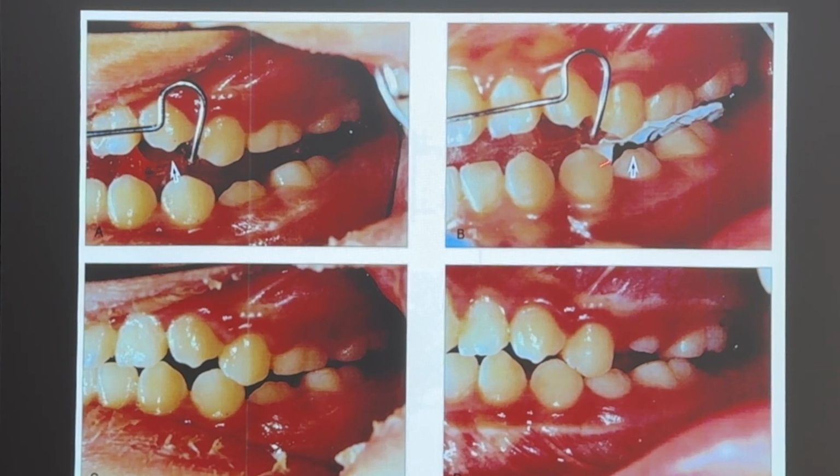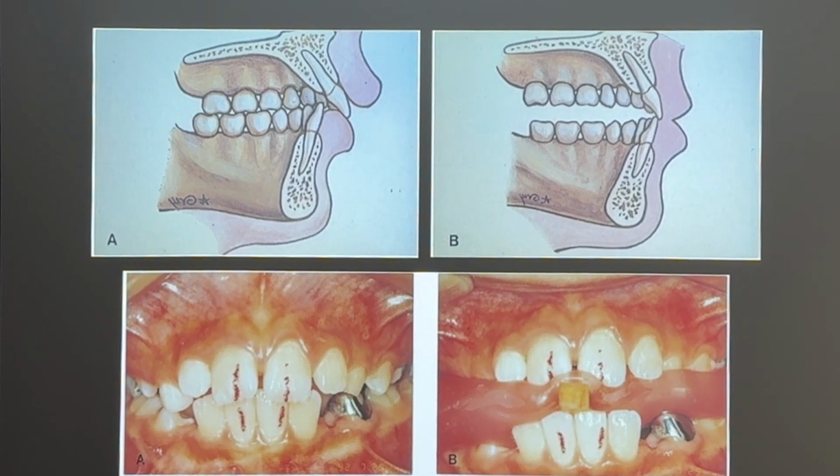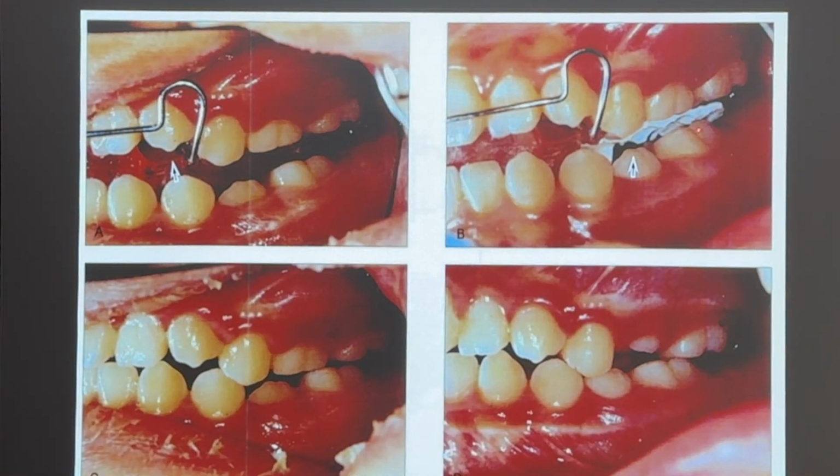I want to take a good picture for my student. So here, you can see, we can take 1 millimeter of space in the occlusal area.